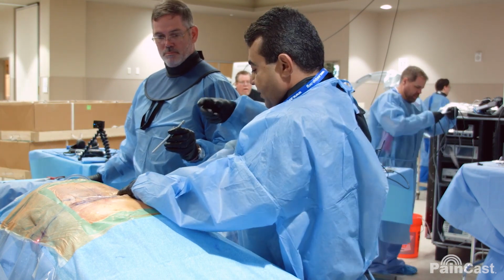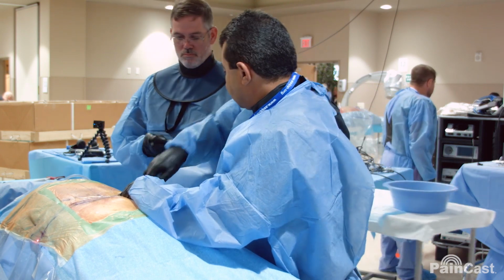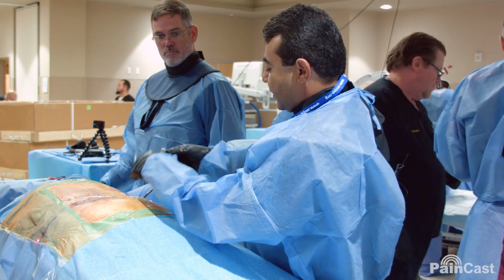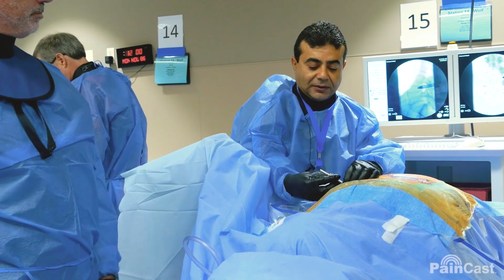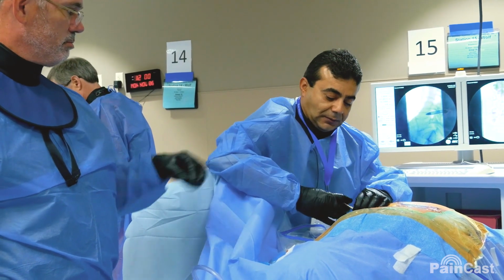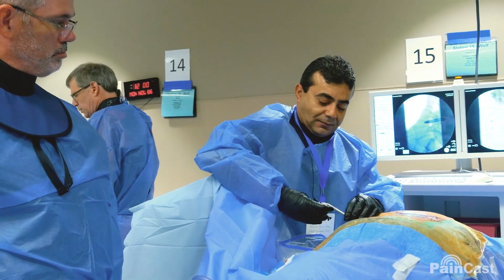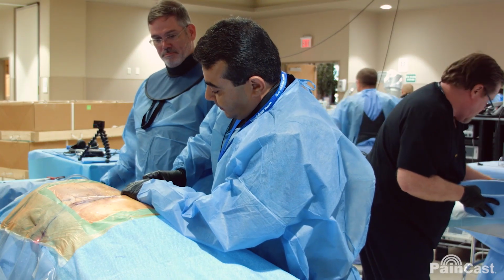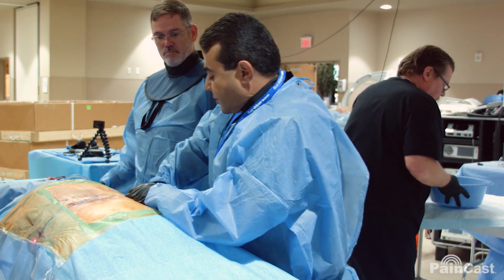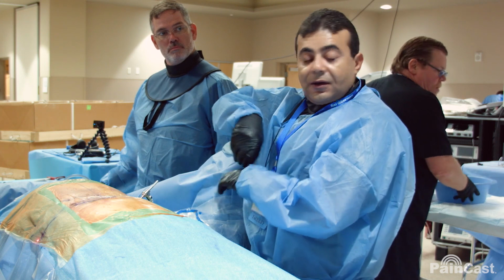Let me have the connector piece. I'll get the connector piece. Always make this go down against the black one on the opposite side, so that will mark where. No, flip it over. X-ray. So we see we're going through. X-ray. Okay.